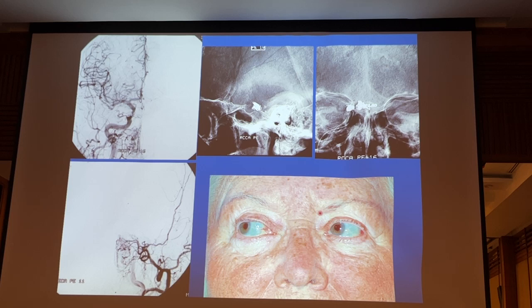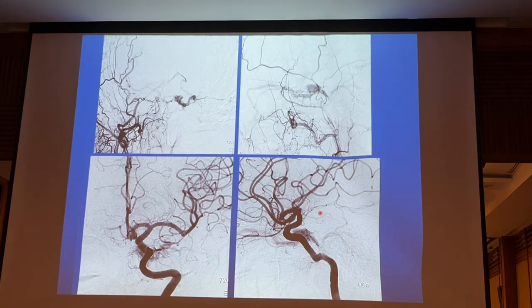I used to have it. I don't think they produce it anymore. And there is a short fibered coil. You can use it cheaply. Instead of a $2,000 coil, you can use $100 fibered coils. Multiple coils can be replaced.